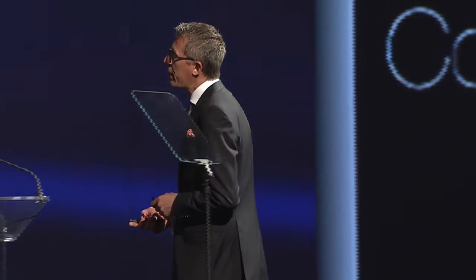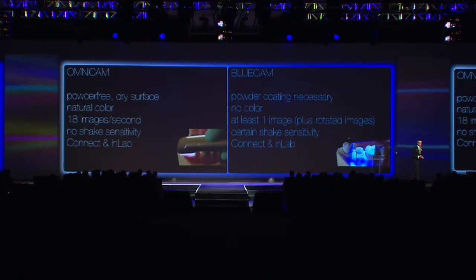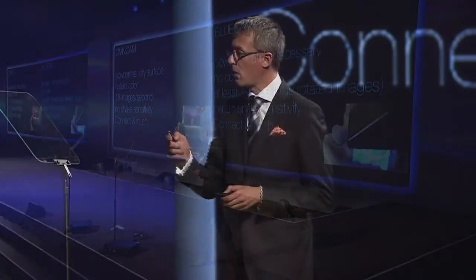So let's compare again the OmniCam with the blue cam. With the blue cam, we need the powdering, we need this coating. You know all the different materials we have on the market to create this powder coating. With the OmniCam, it's powder-free, no powder, but we need a dry surface. You have to blow out the saliva, we need a dry surface.